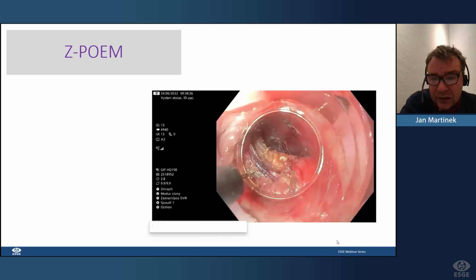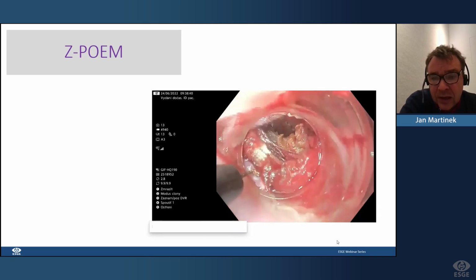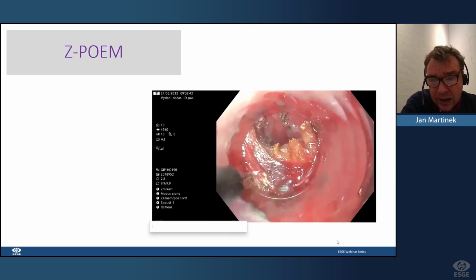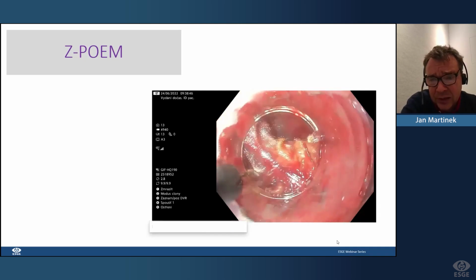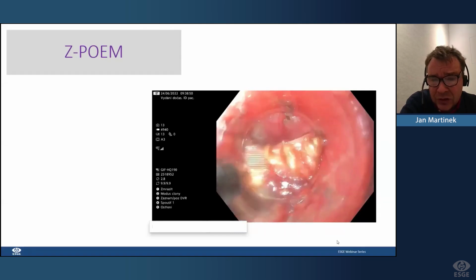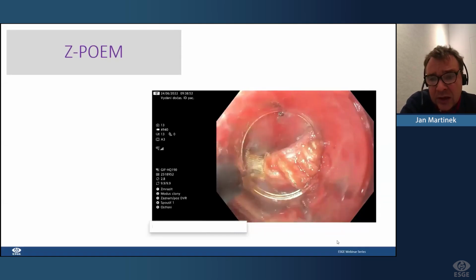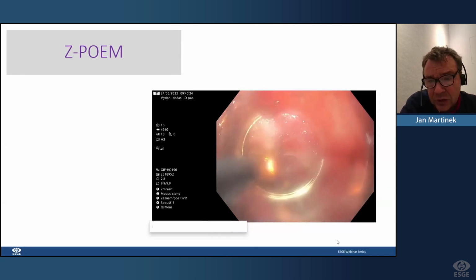And on the other side is the cricopharyngeal part, or diverticular muscle, and the aim is to cut the complete cricopharyngeal muscle, like you can see here. There is no need to cut the esophageal muscle to the cardia. I think I usually cut it to the same level as the cricopharyngeal muscle.